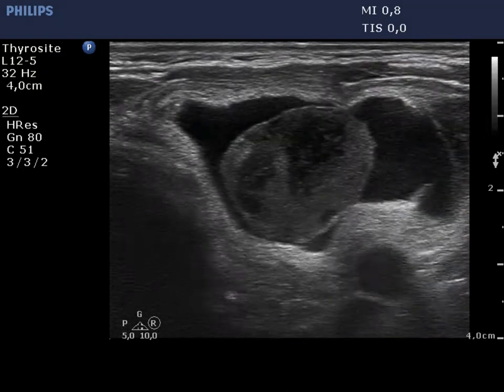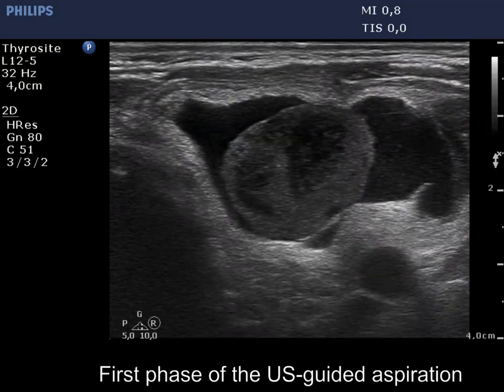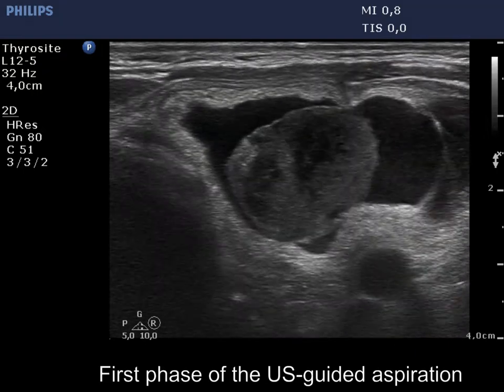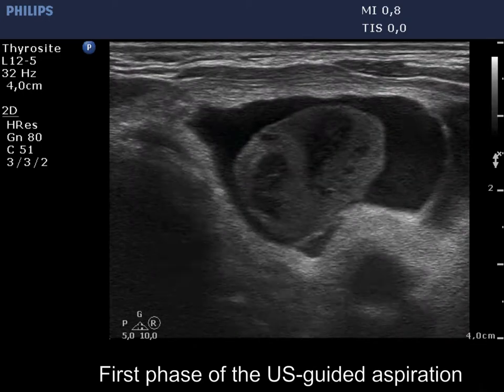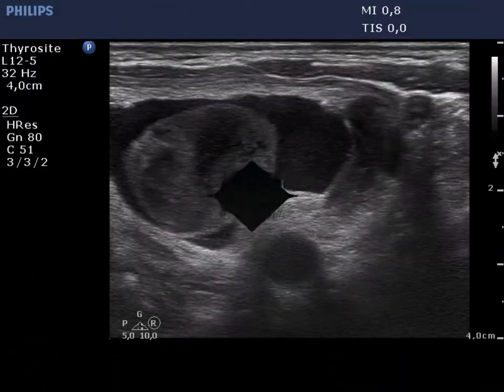Now, the phase of aspiration begins. The continuous shrinkage of the nodule is evident.